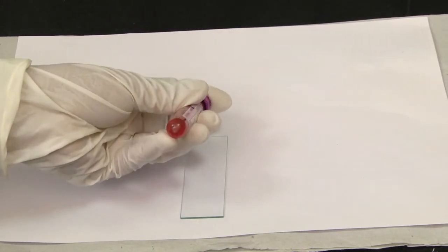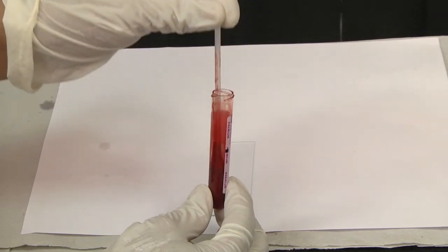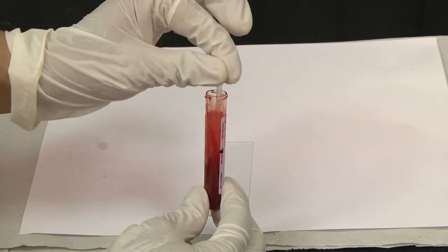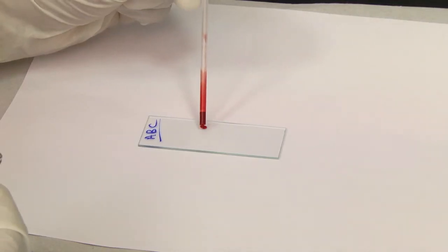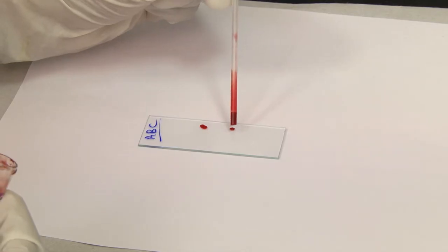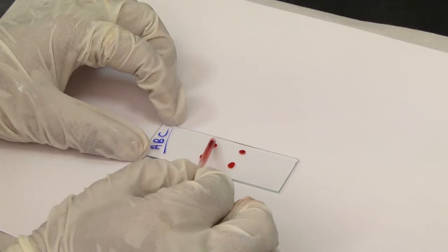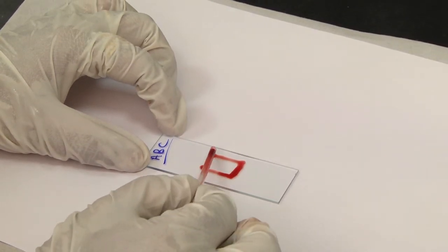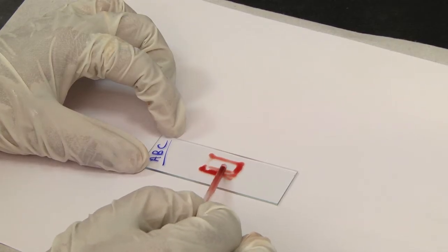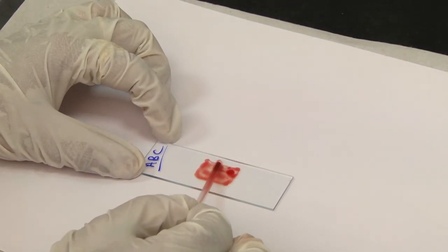Mix the sample by inversion. Open the cap gently and check for clots by dipping the applicator stick in the tube. Next, using the applicator stick, place 3-4 small drops of blood on the slide. Spread the drop of blood with a corner of another slide or an applicator stick to make an area about 1.5-2 cm in diameter.